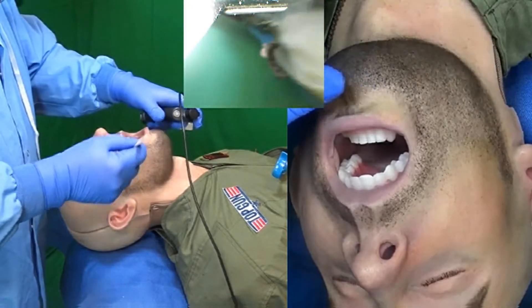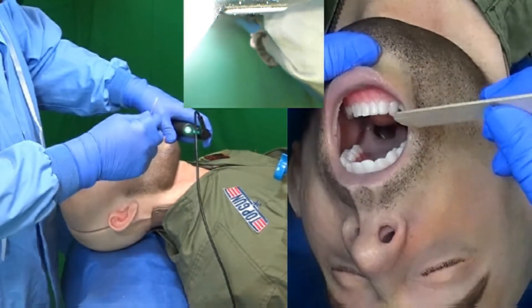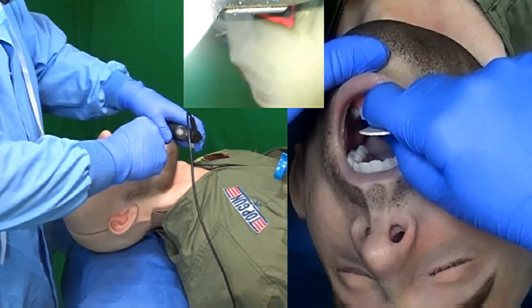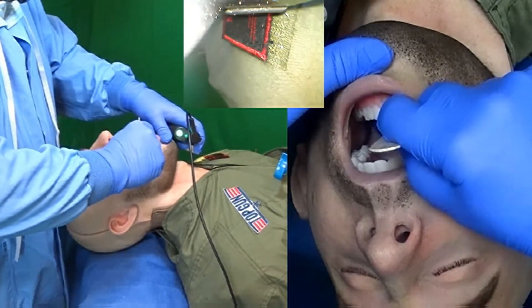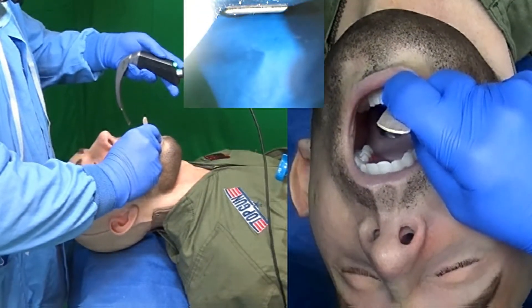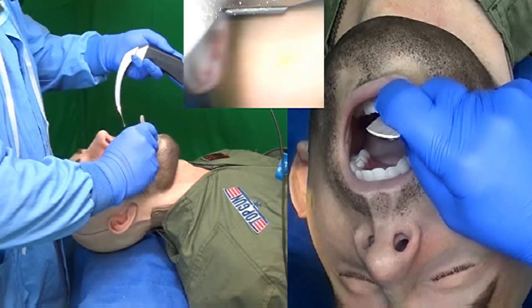I'll begin by opening using my thumb against the chin on the mentum to open the lower mandible as maximally as possible. I want to place this tongue depressor directly into the mouth to the back of the tongue. Now I'm going to perform that scissor maneuver with my middle finger against the upper dentition.